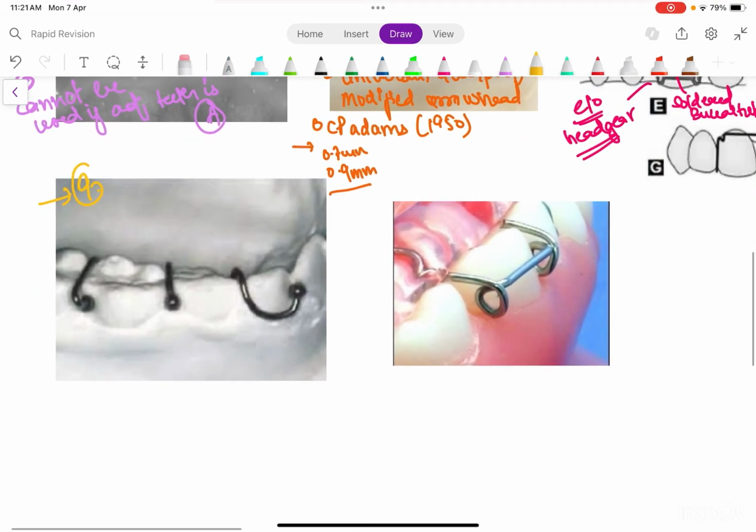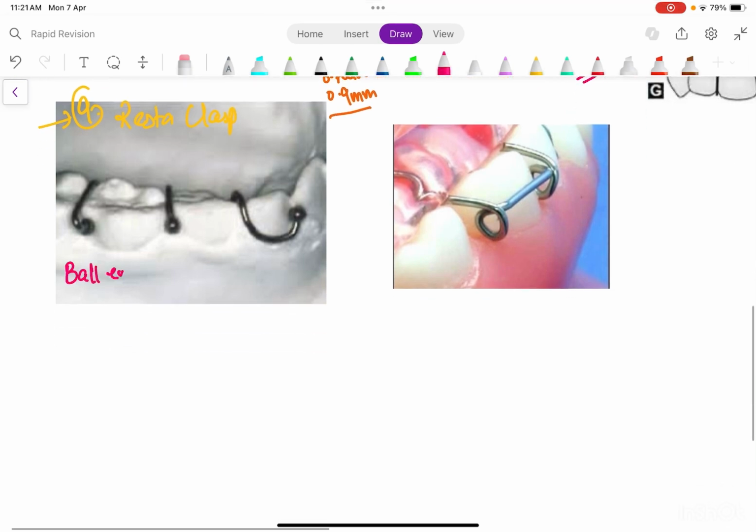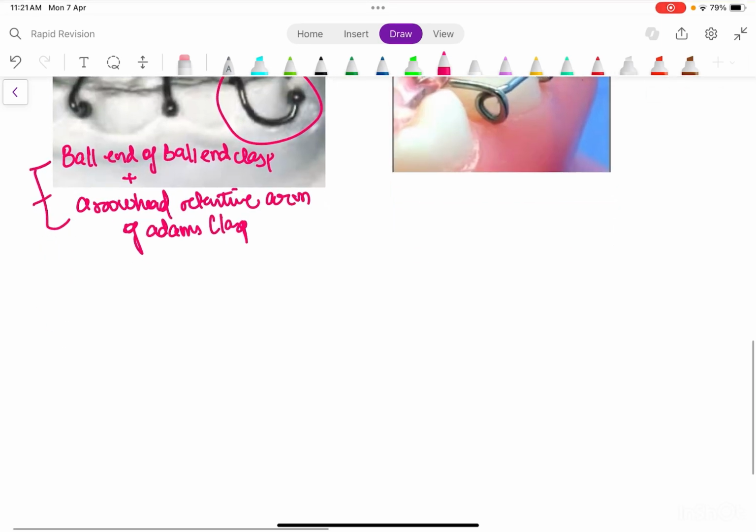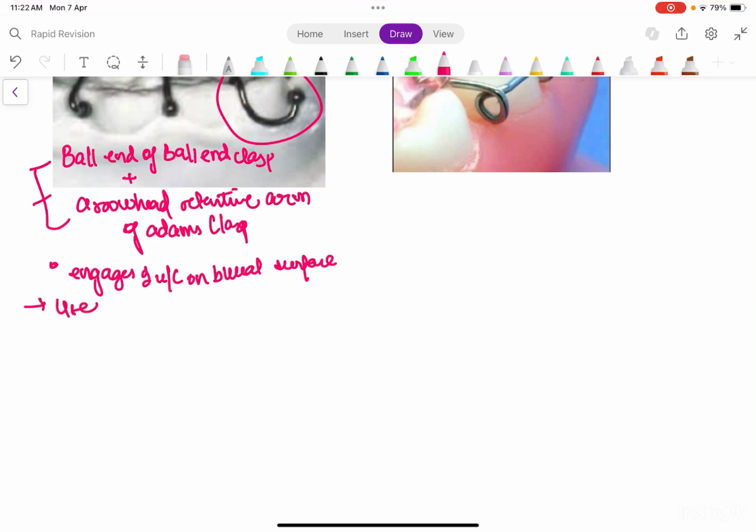Then coming on to this one, this is particularly different from what we all know. So this is 9th. This is called a Resta clasp. Now in Resta clasp we have a ball end clasp plus the arrowhead retentive arm of Adams clasp. So it basically is a combination of both. Then it engages two undercuts on the buccal surface. It is used when interocclusal clearance is available only on one side.